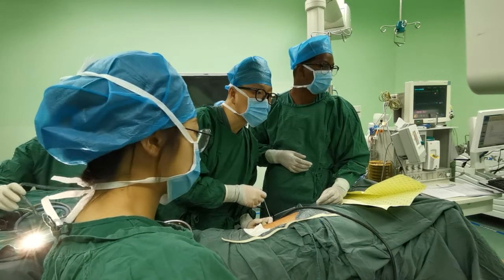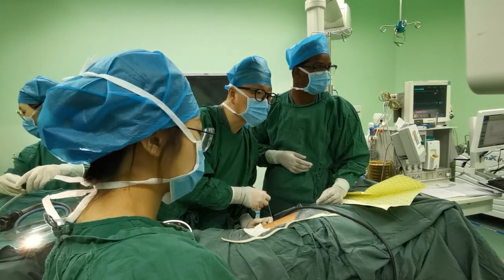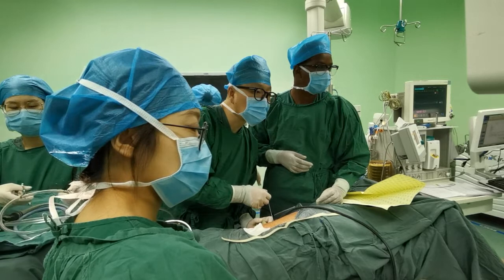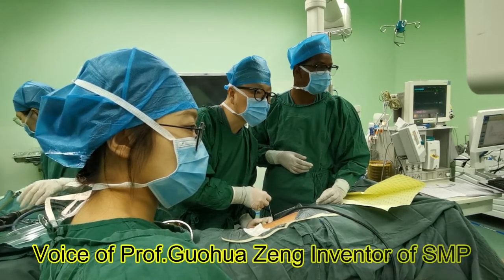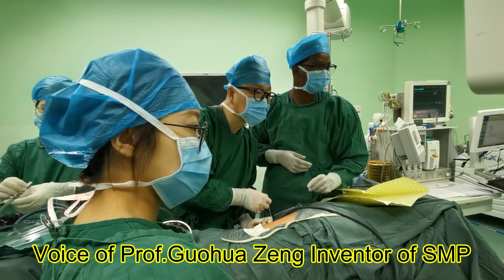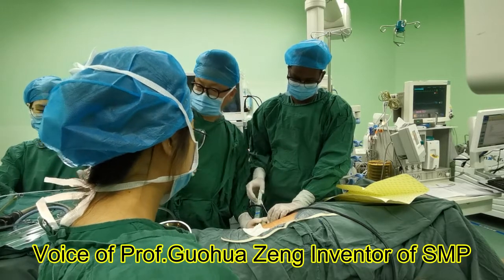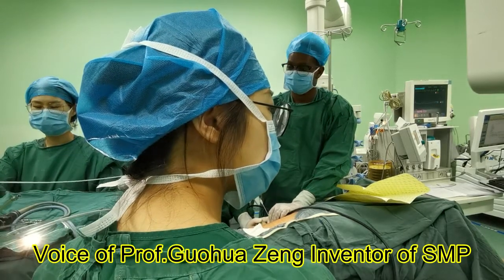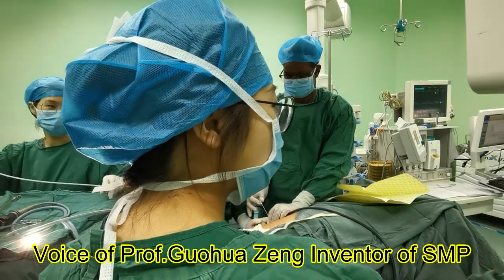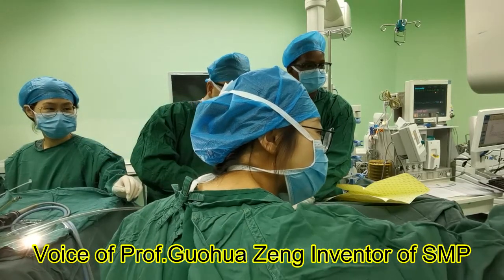I will introduce the SMP technique. SMP technique uses sheaths of only 12 and 14 French with an irrigation suction sheath. With this small size sheath and continuous active suction, it causes really less bleeding and lower pressure, and really less urosepsis. With this suction sheath, stone fragment removal is effective and operation time is shortened.